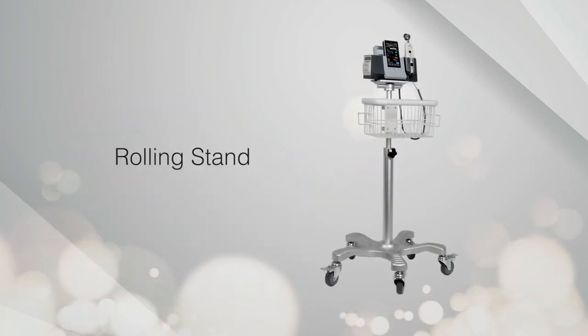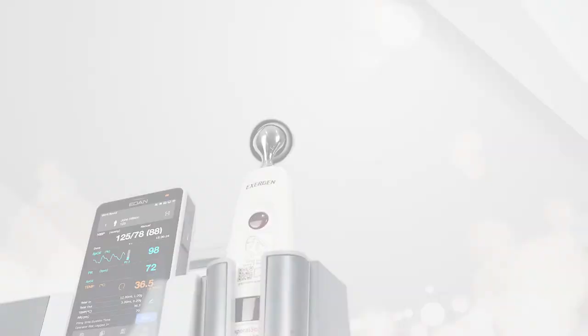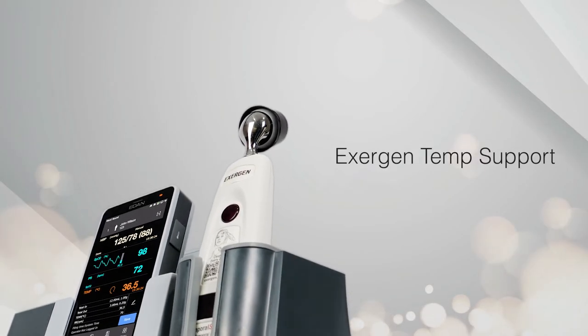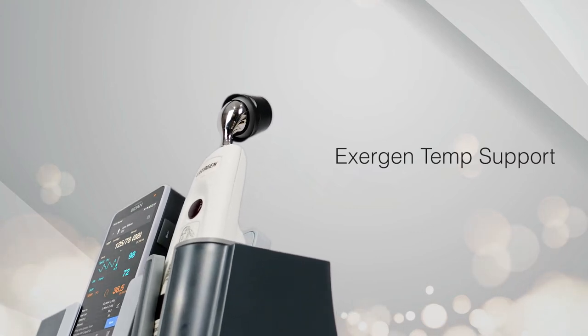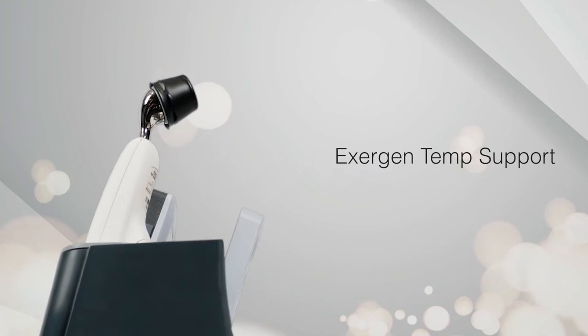You can also fix the device on a rolling stand, maximizing its mobility. Through an upgrade of the CS05, thermometers like Exergen can also be integrated and used together with the device for temperature monitoring.